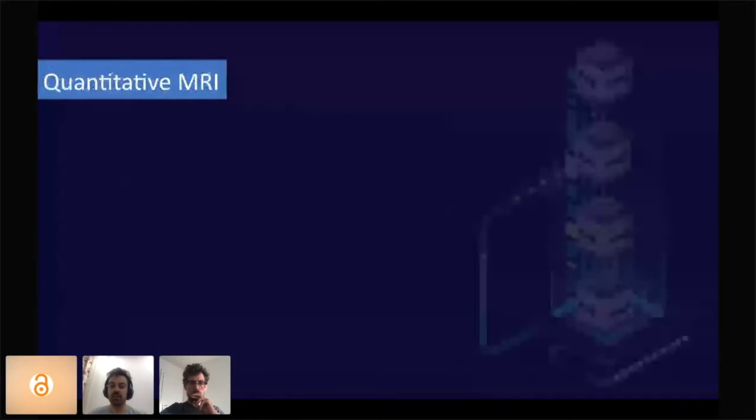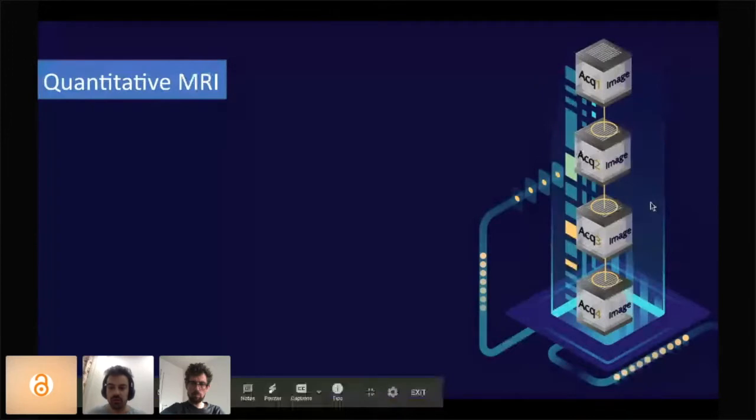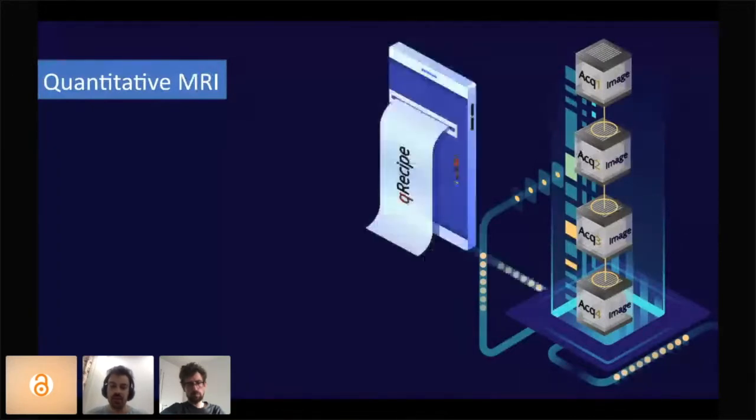Whereas quantitative MRI aims at calculating meaningful numbers per voxel that come in physical units. And this is achieved by collecting multiple conventional-like MRI images by systematically altering acquisition parameters between these constituent images of a group scan. And then we use a mathematical recipe to derive those numbers.